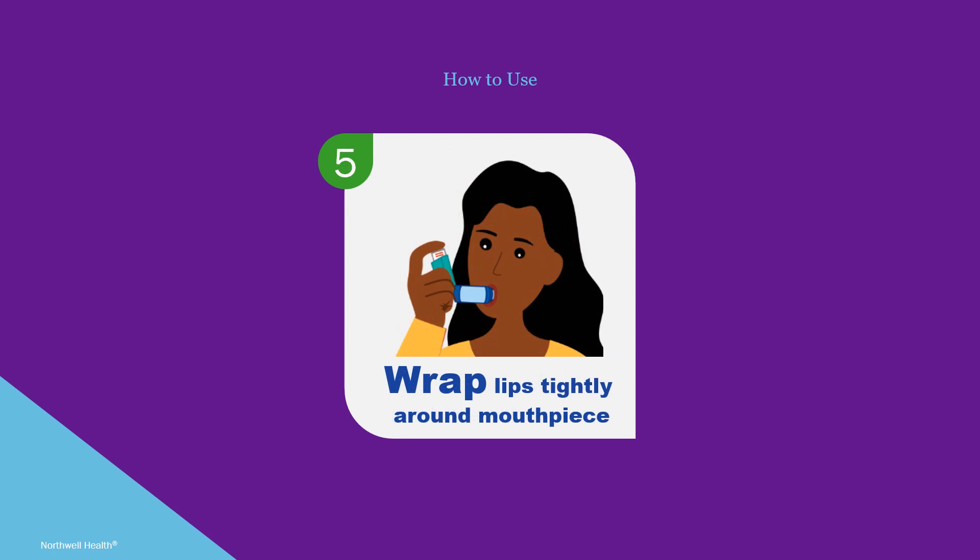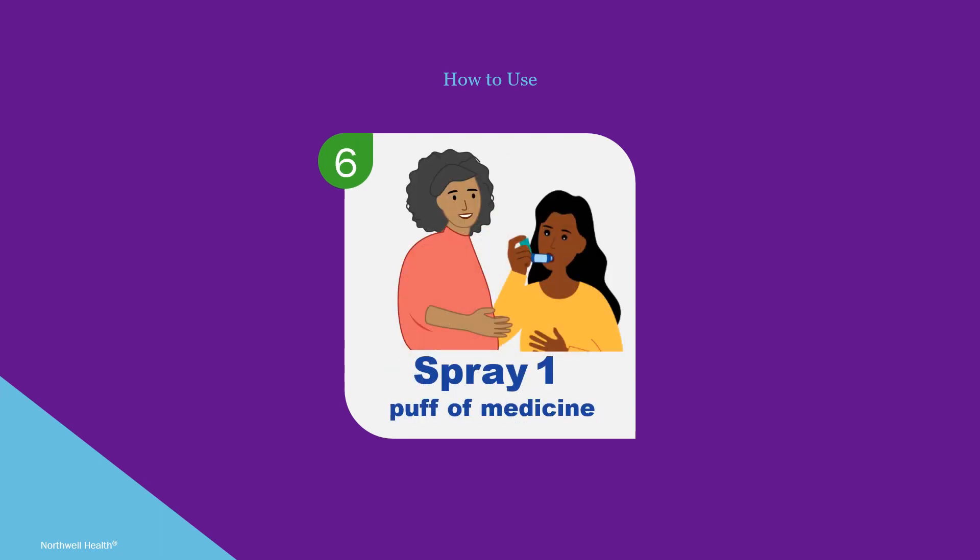Place the mouthpiece of the spacer in the mouth. Make sure to wrap the lips tightly around the mouthpiece. Next, push down on the inhaler once — now the medicine is inside the spacer.